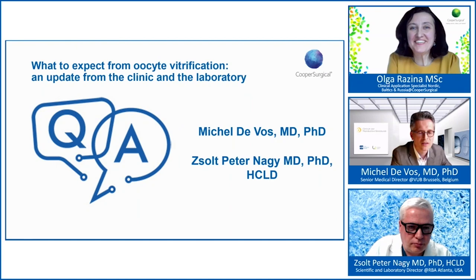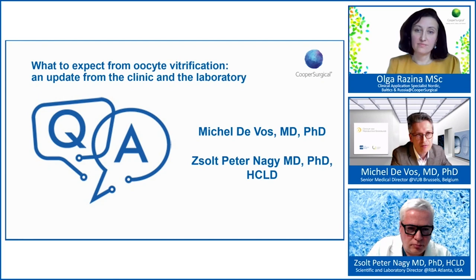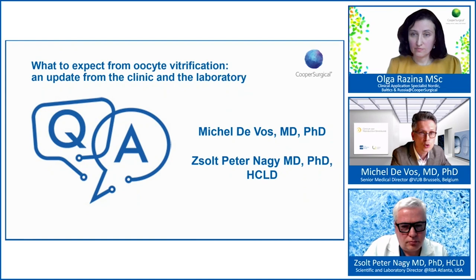Well, in typical situations for planned oocyte cryopreservation, we discard immature eggs. We only vitrify eggs that have shown the metaphase 2 stage, although in specific circumstances, such as cancer patients who only have this single unique possibility to cryopreserve some eggs, we would believe that it could be an option to mature the immature oocytes in vitro. The problem there is that to ascertain that they are immature, you have to denude the oocytes. And we know that denuded oocytes lack the support from the cumulus. By doing so, the potential of these oocytes is rather poor. But for cancer patients, it could be an option.